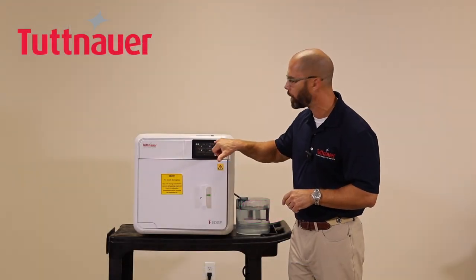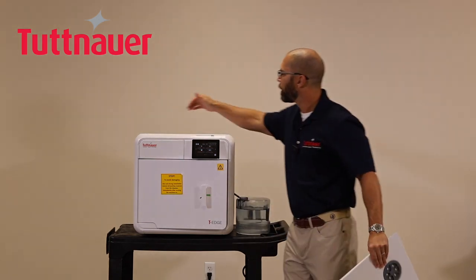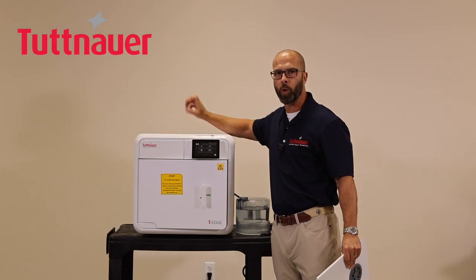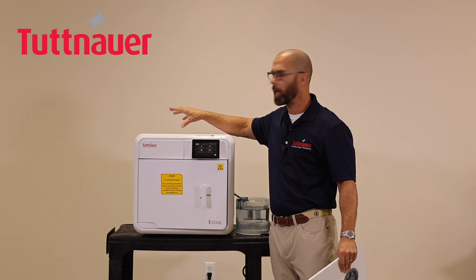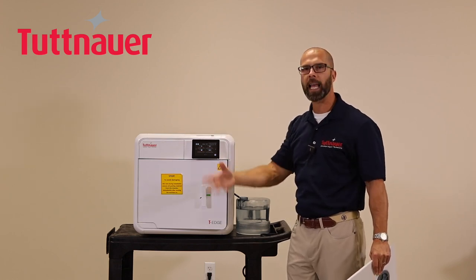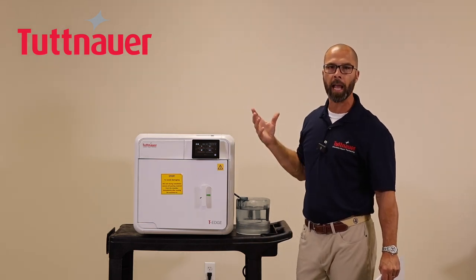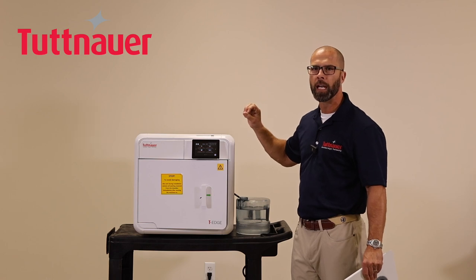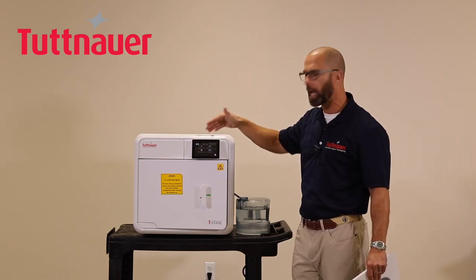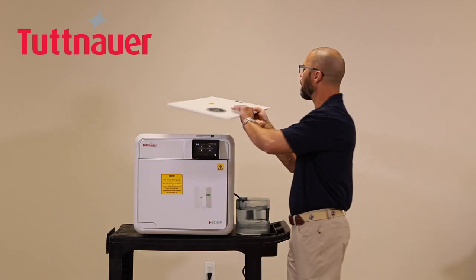The two teardrop icons on the display represent the two water reservoirs on top of the machine. The left teardrop is the clean water reservoir — this is where you fill distilled, mineral-free water. After each cycle, used water is pumped up into the waste water reservoir on the right. The clean reservoir holds about 155 ounces — a little over a gallon — giving you approximately 8 to 10 cycles per full reservoir.